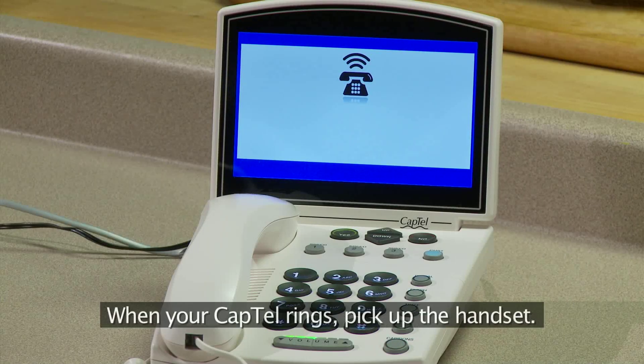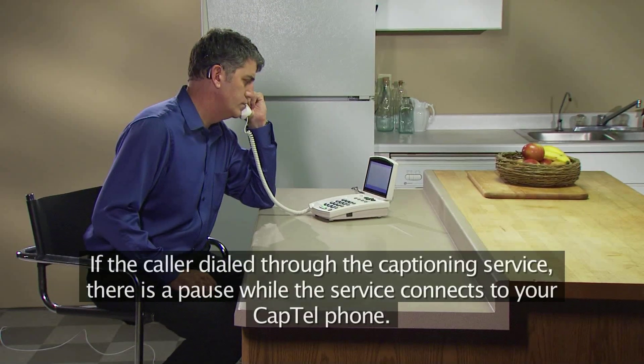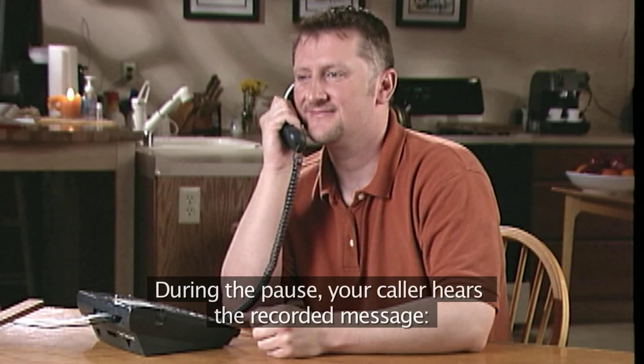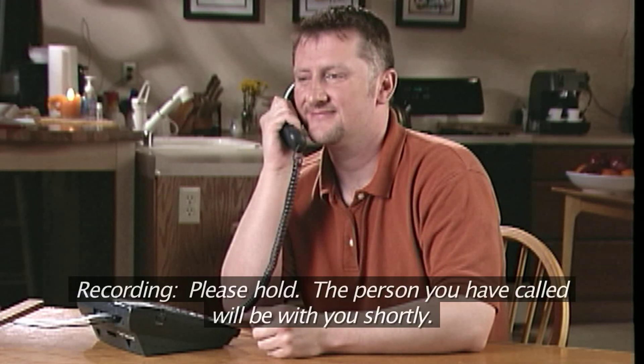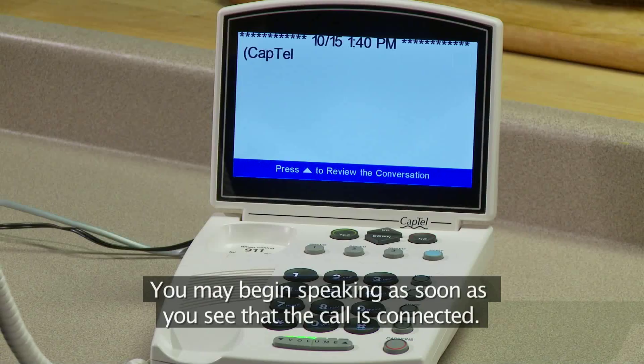When your CapTel rings, pick up the handset. If the caller dialed through the captioning service, there is a pause while the service connects to your CapTel phone. During the pause, your caller hears the recorded message: "Please hold. The person you have called will be with you shortly." You may begin speaking as soon as you see that the call is connected.